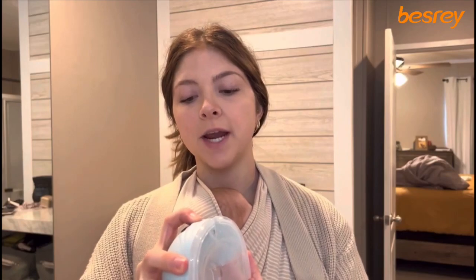It also has a two-and-a-half hour charge time, which is great, and it has an auto shut-off at 20 minutes. Honestly, everyone is different and I think this has a setting for probably everyone.